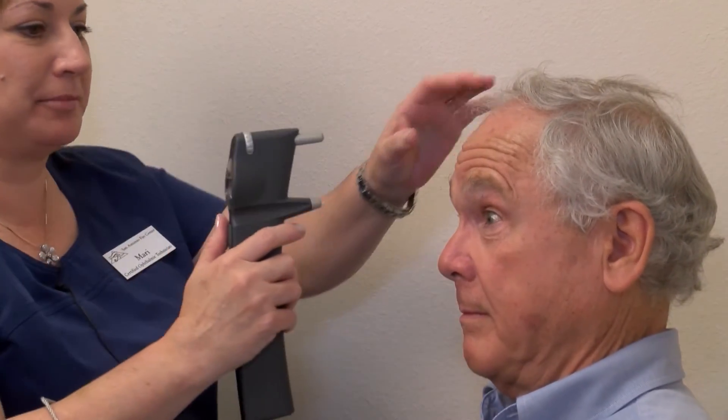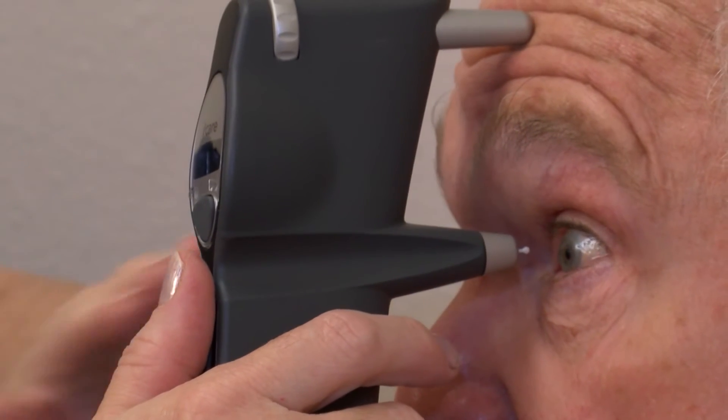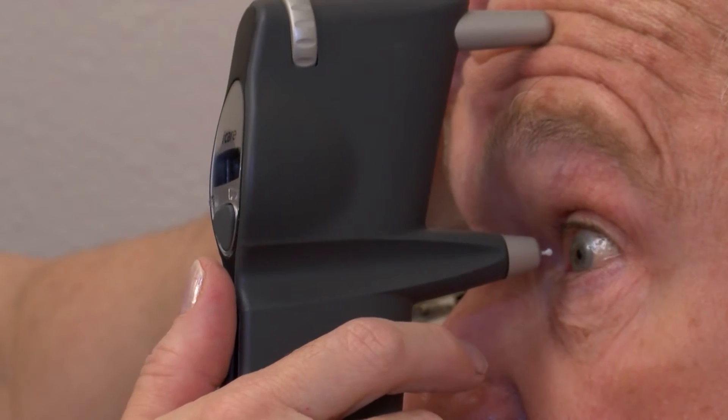This is an iCare tonometer. We're going to take Dr. Harris's pressure. Dr. Harris will look exactly parallel across the room. We're going to get this little head rest right there on his forehead. He's going to look straight ahead — it's parallel — and we're going to press the button.